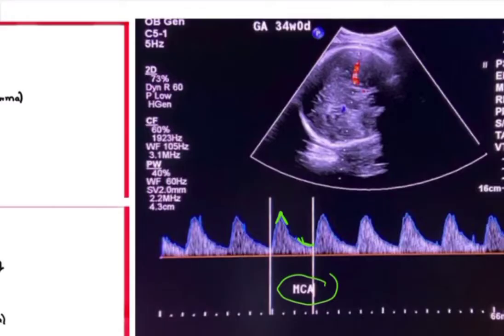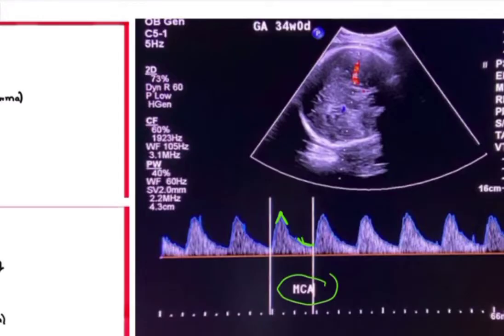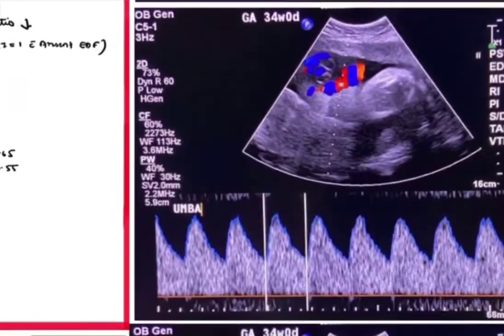Increased PSV is seen in fetal anemia, and increased end diastolic flow is seen in fetal IUGR when there is brain sparing effect. Usually the MCA is a high resistance artery, so end diastolic flow is very less. But once there is IUGR and the brain gets less blood, there is brain sparing effect and the MCA dilates, so end diastolic flow increases. The two abnormalities to look for on the waveform are raised PSV and raised end diastolic flow.